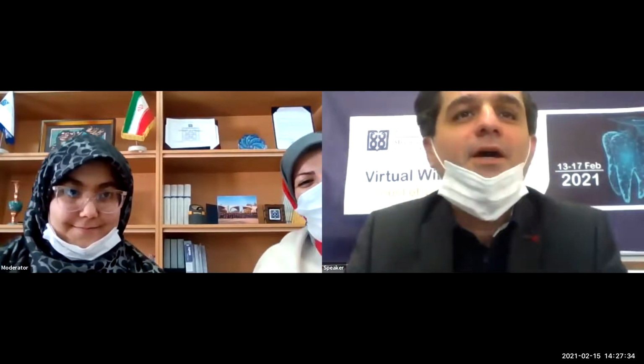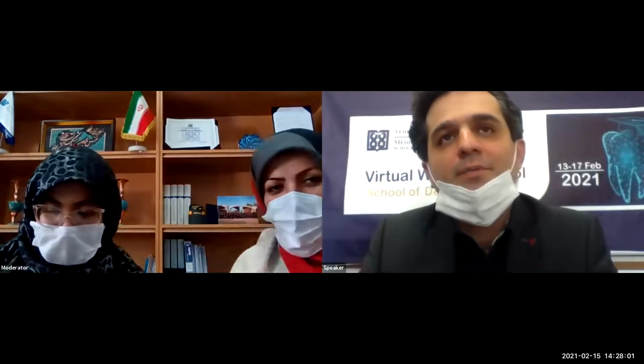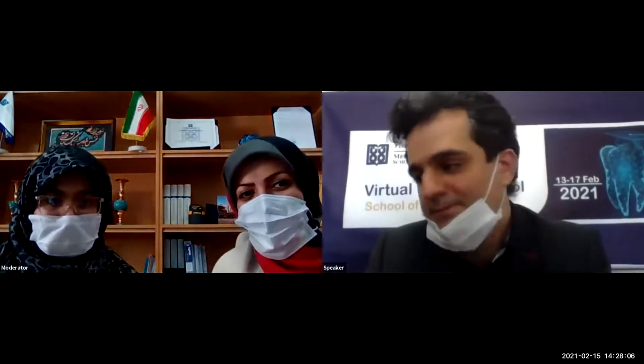Hello, everybody. I hope all is well. I am Dr. Pejman Ismaili Fallah from Tehran. I will share with you some considerations about aesthetic dentistry and talk about white aesthetic dentistry and the aesthetic score. After that, I will talk about composite layering art. And at the end, I will show a movie of making a feldspathic laminate.